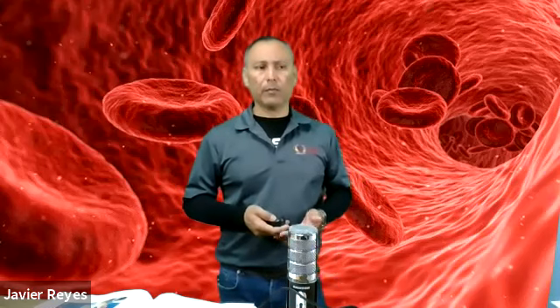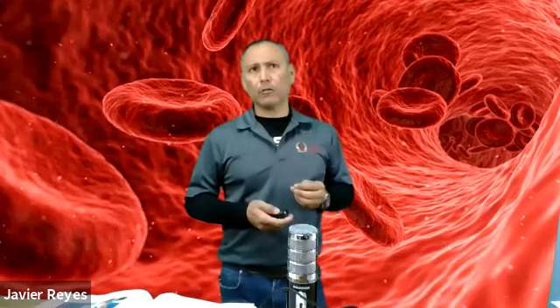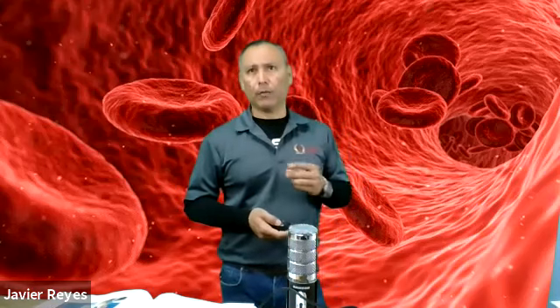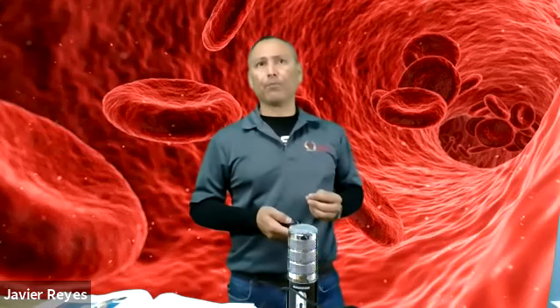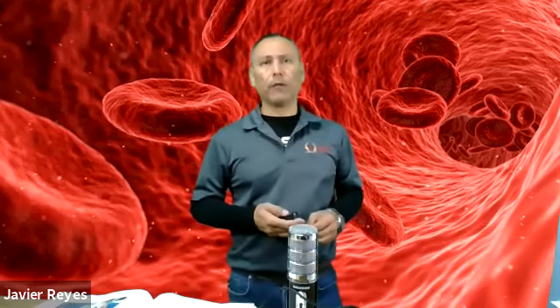And that's the main reason we perform a capillary puncture to collect a glucose sample when we cannot collect a venous sample. Other elements in capillary blood samples, your total proteins, calcium, and potassium, are lower in capillary blood versus venous blood.